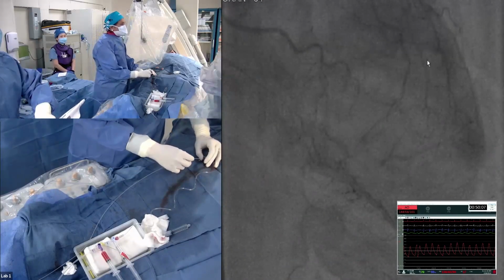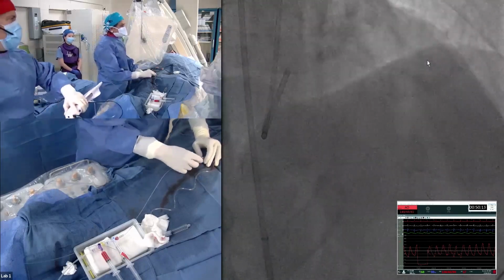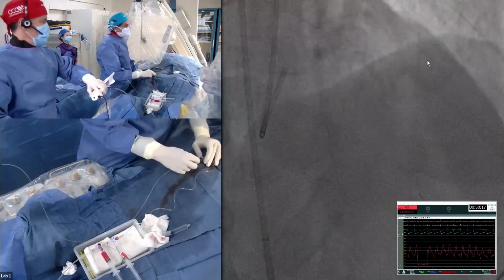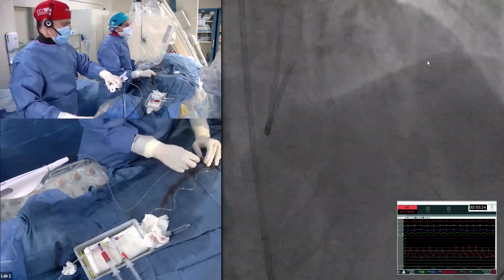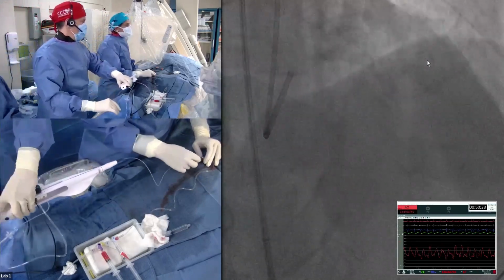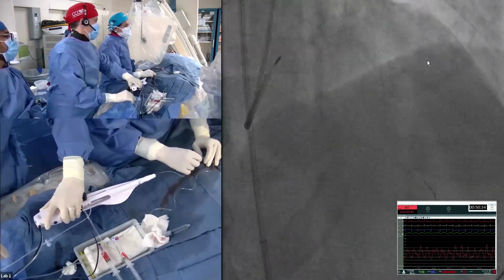There's just too much calcium, too much angulation. There's going to be too much frustration trying to get down there. I don't think you need any additional information other than the angiogram right now to tell you that this is going to need atherectomy. I share your concern about this extreme wire bias and downsizing the burr. Yes. This is not going to look pretty after the burr goes through that, just because of the bias. You're going to have almost like a double lumen there. But it will break it up enough to allow for delivery of other devices.